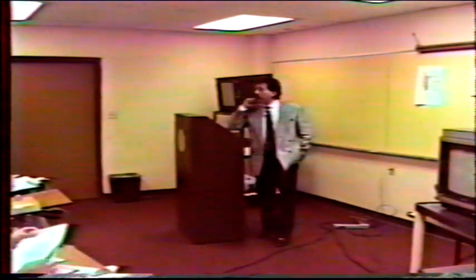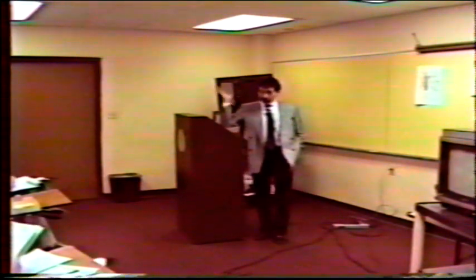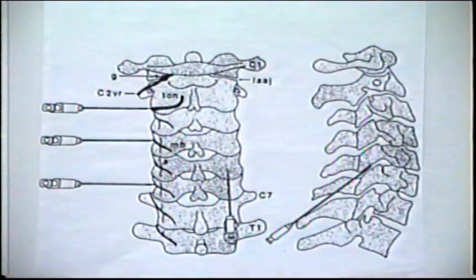4:47. I would like to specifically bring your attention to the techniques. Dr. Baduk is advocating 2 types of technique in the injection of the cervical facet joints. One type of technique is the posterior lateral approach, which I demonstrated during the demonstration section.